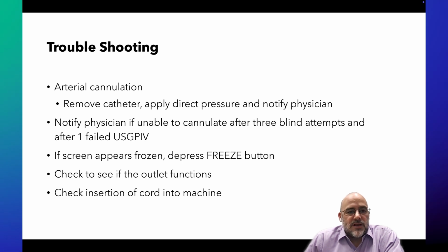Notify the responsible provider if you're unable to cannulate after 3 blind attempts or after 1 failed ultrasound-guided IV. You'll develop a practice pattern for this, but those are some rules of thumb that I have. Sometimes if the screen is frozen, it's because the freeze button has been pressed. I've seen that be the issue. And then check to make sure that you're not going to lose power in the middle of the procedure, and that the cord not only is in the outlet, but also is plugged into the machine. Sometimes that connection gets loose.